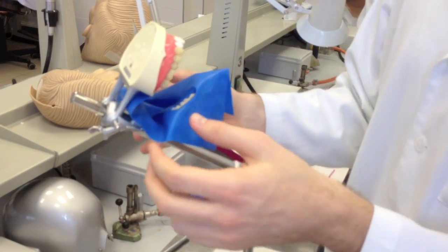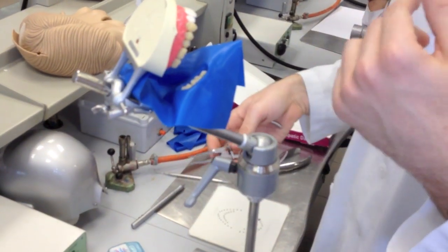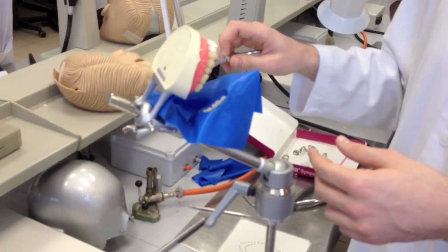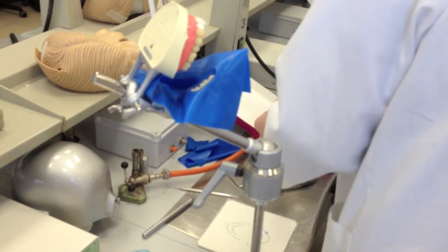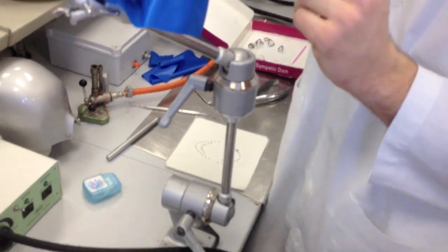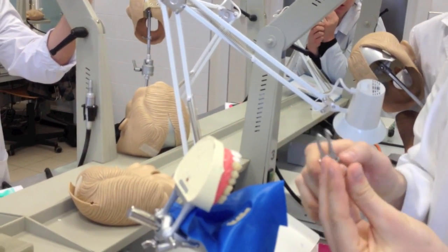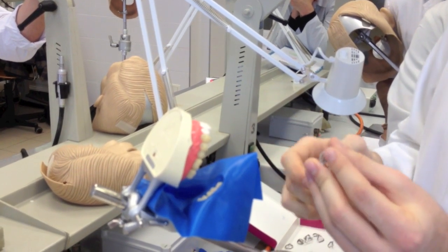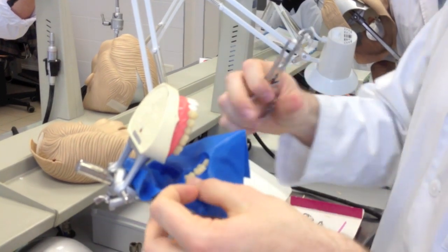The rubber is on. But I made a mistake — before you place the rubber, you have to try on the clamp to be sure that it fits properly. For this case, I can choose a universal molar clamp. You can see both of the faces are smooth, and it's wingless. But it's not a problem now because first I placed the rubber, then I placed the clamp. First I've tried it on — hopefully it will fit.